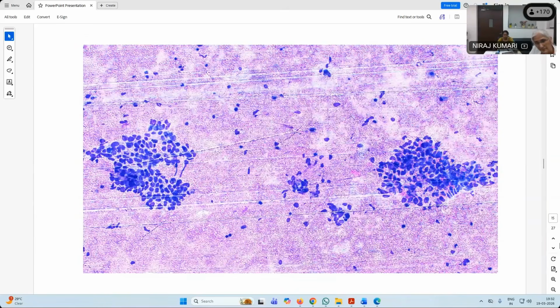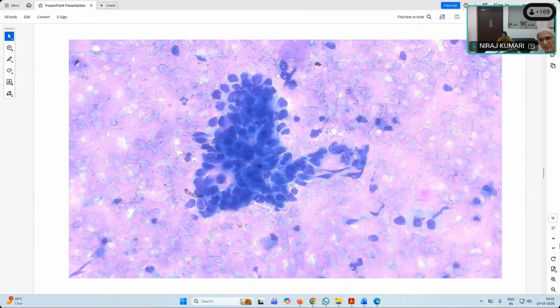Okay, Dr. Sagar? Yes, ma'am. Okay, so here can you see the background? Yes, ma'am. What kind of background? Fibrillary background. Not exactly fibrillary. Fibrillary is more homogeneous, more pinkish. Granular rather. Granular, okay. Does it look something like gelatinous or liquid? The next slide has more.